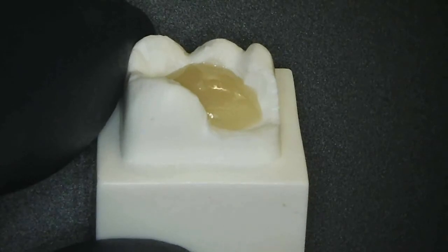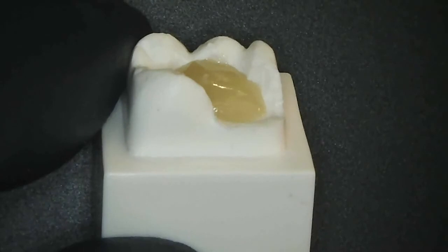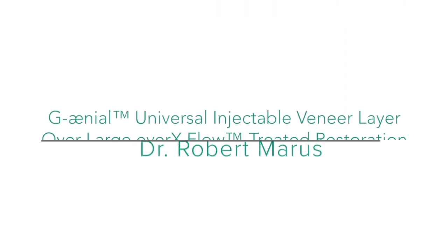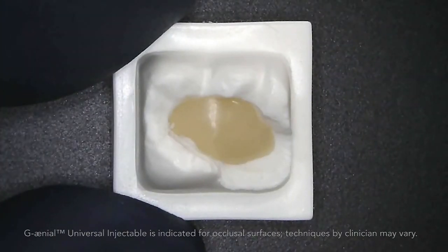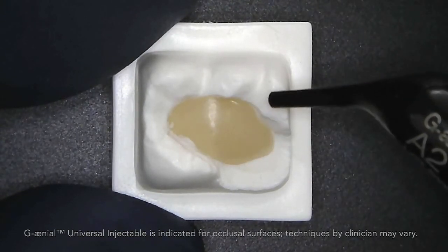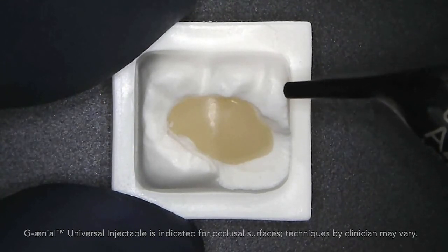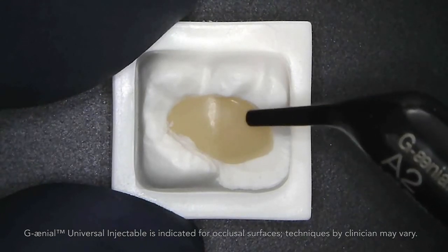Or this could be your core for a crown after root canal is done. Again, this is called Everex Flow, and this is the dentin shade. Geneal Universal Injectable now comes in a unit tip application, and here I have a substructure of dentin created with Everex Flow — a glass-reinforced fiber composite flowable — as my dentin replacement.